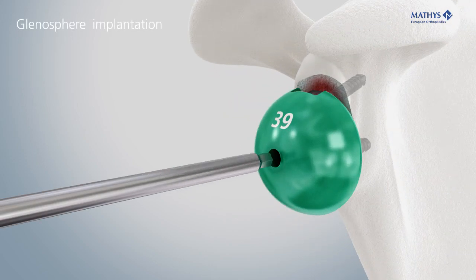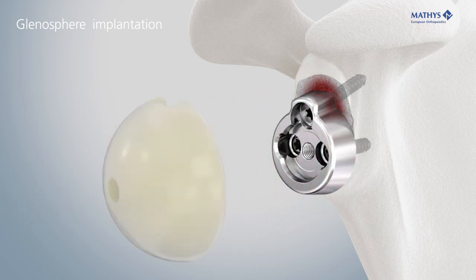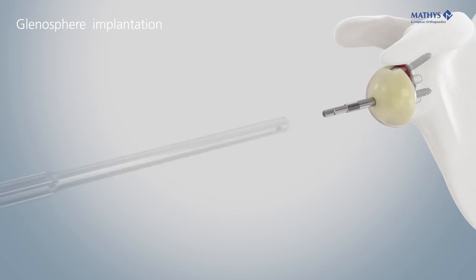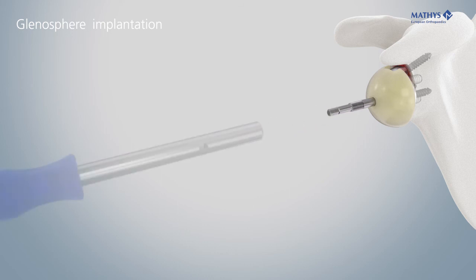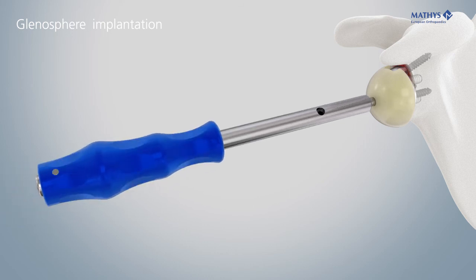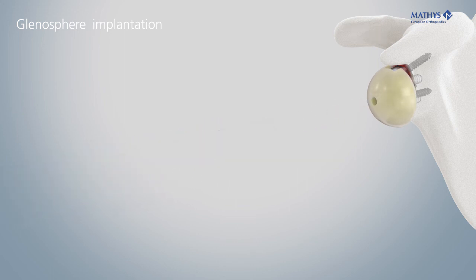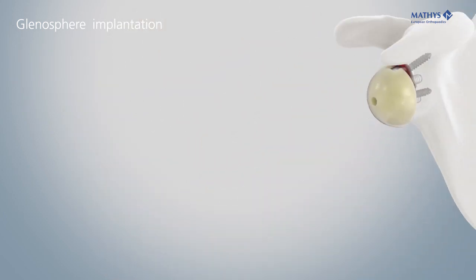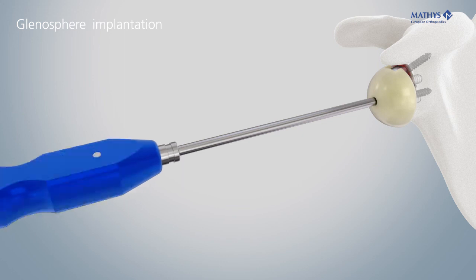After choosing the glenosphere and inlay sizes, place the definitive glenosphere into the metaglene. Screw in the metaglene assembly rod and then screw the glenosphere pusher over it. This will snap the glenosphere onto the metaglene. Check the complete connection between glenosphere and metaglene; the superior cutoff of the glenosphere needs to be flush with the metaglene. Finally, screw in the fixation screw to secure the glenosphere.